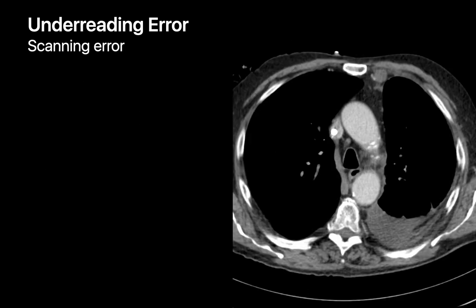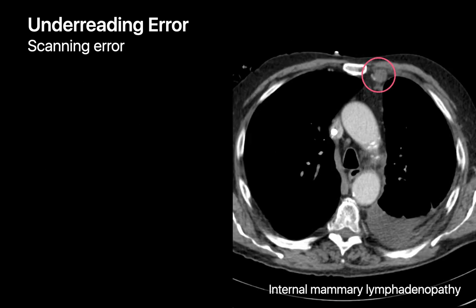An example of a scanning error is this case of left internal mammary chain lymphadenopathy. The internal mammary lymph node chains were not part of the search pattern of the first-year resident reading this chest CT at the time, so their gaze never made it to this location.